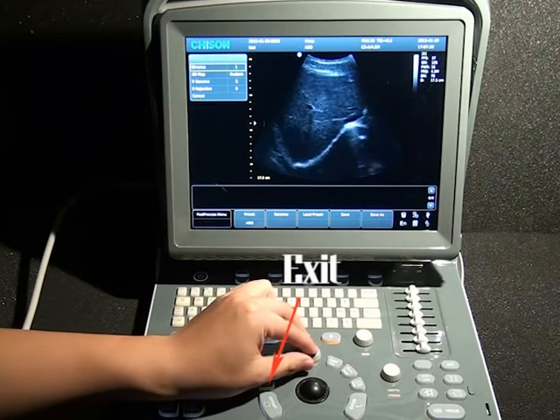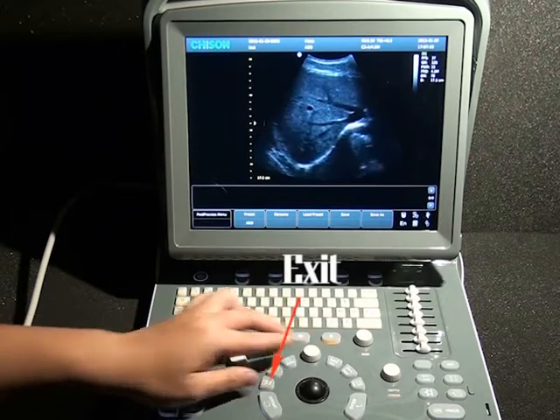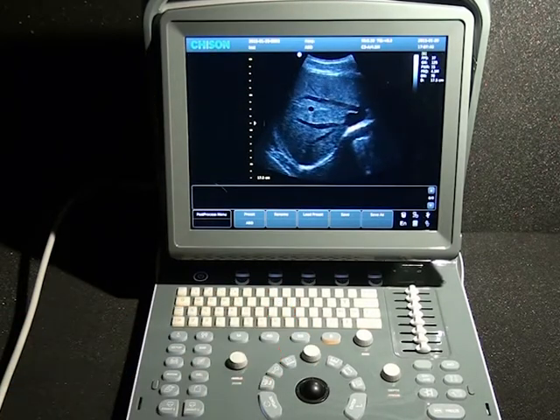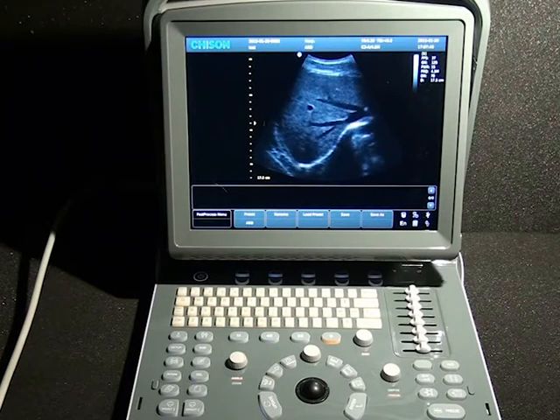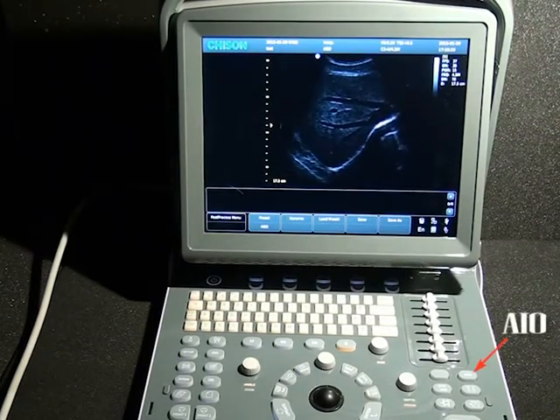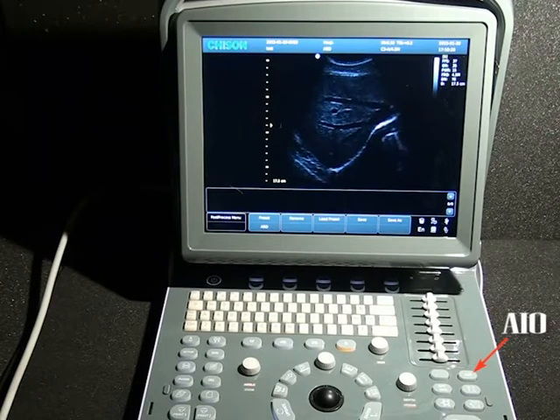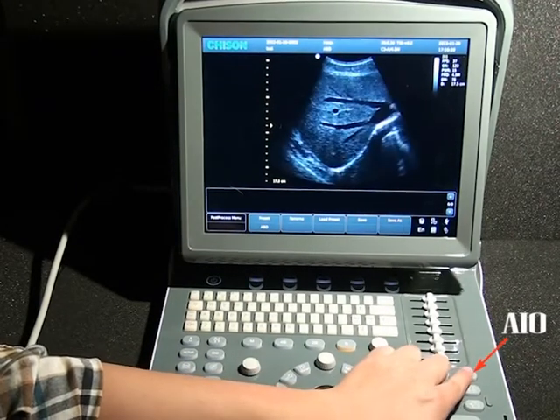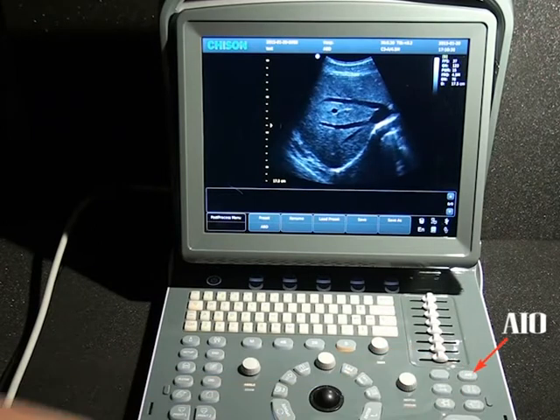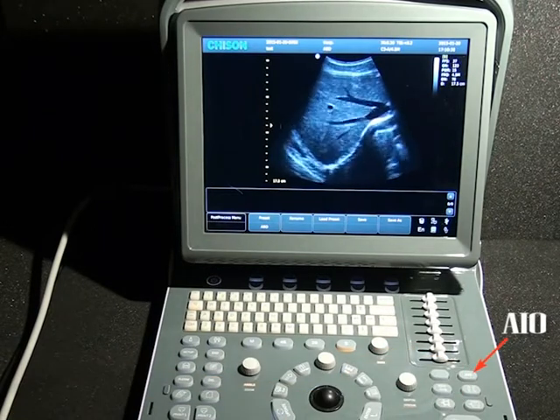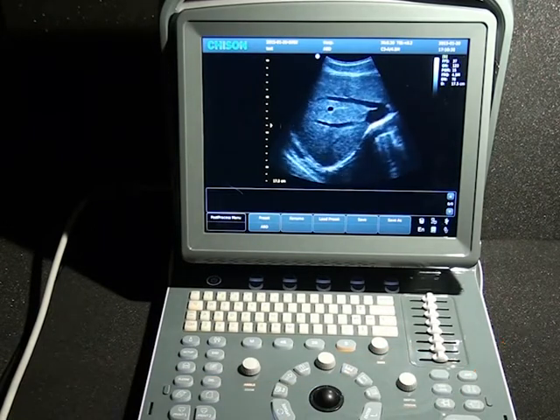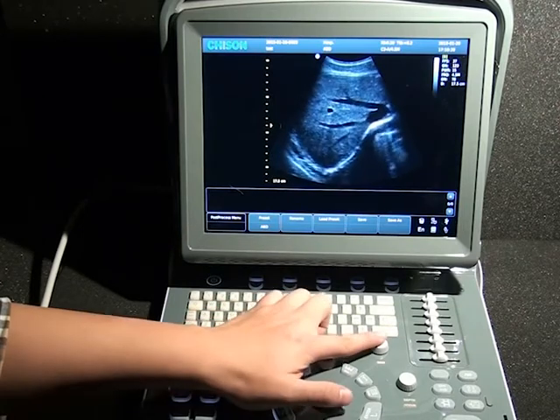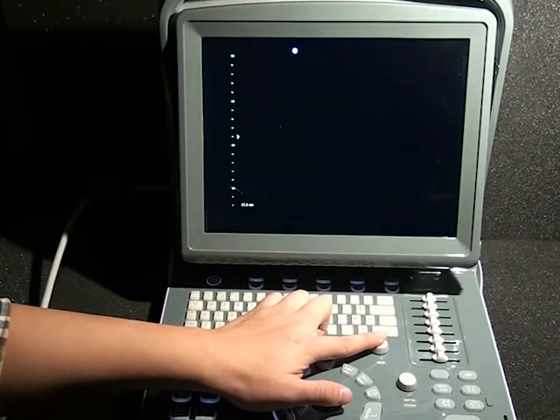When we are done, press the exit button to go back to where we began. What's more, one-key image optimization is available — press AIO, and with just one key, the quality of the image can be brought to a suitable status. We also have a full-screen display mode.